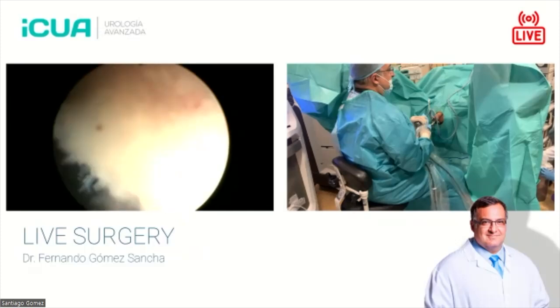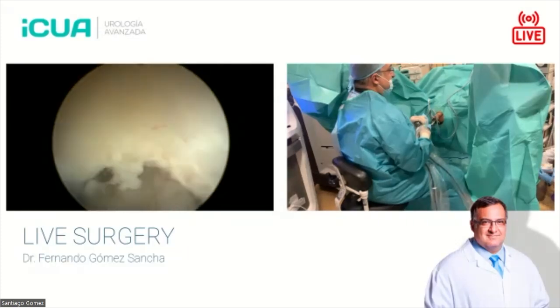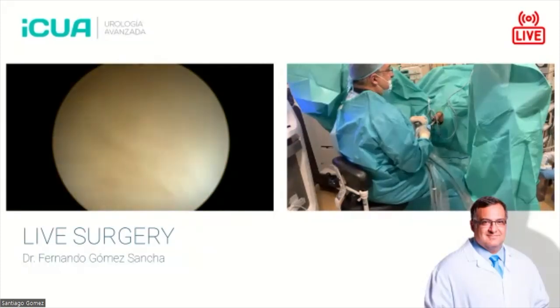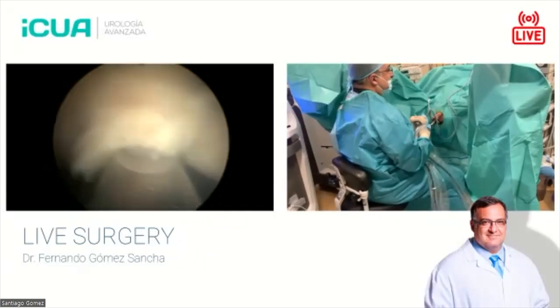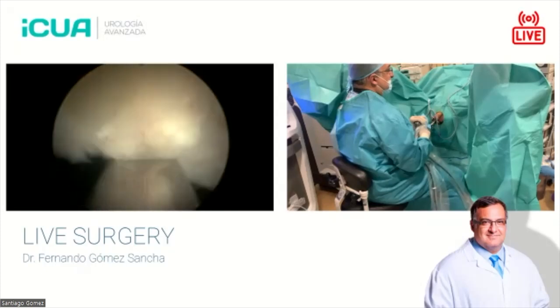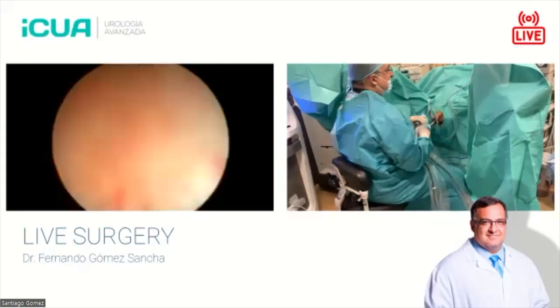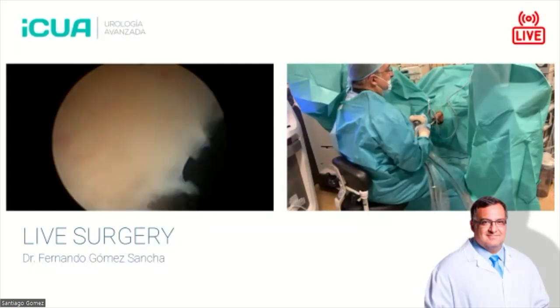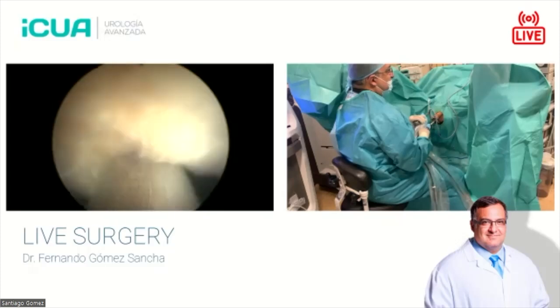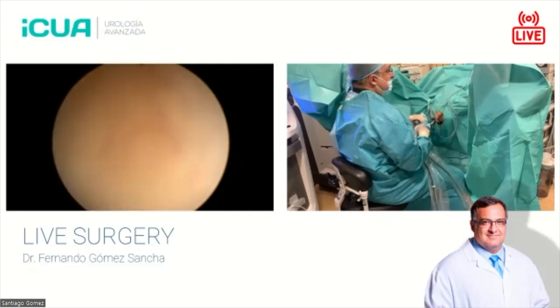Fernando, may I ask you a question? Go ahead. How does the morcellator work when you have stones inside the prostate? Well, if there are a lot of stones, you might get into trouble because the stones can damage the edges of the morcellator jaws, and they could obstruct the motor or the system. So in a very stony prostate, it might be a problem. But I have to say these situations are quite rare.